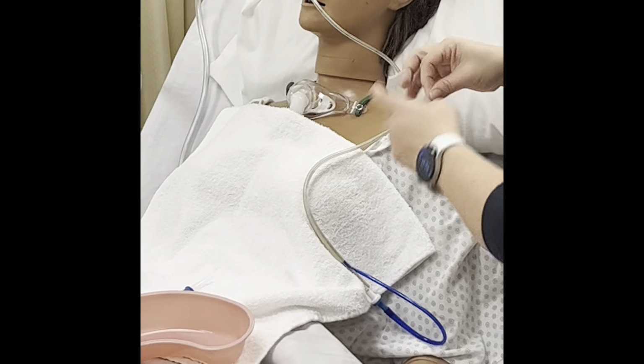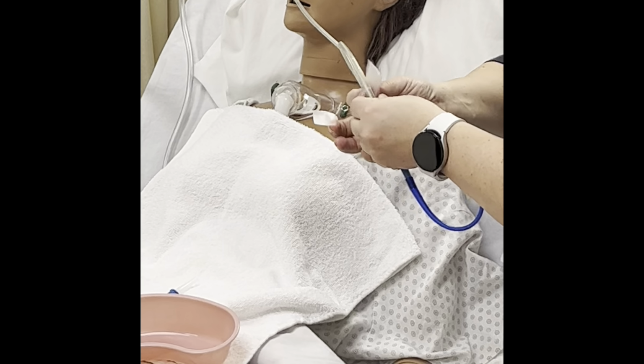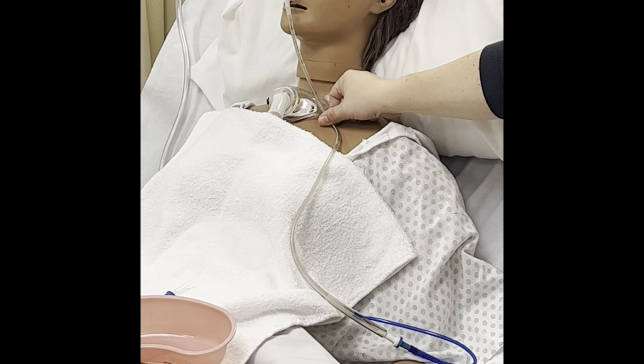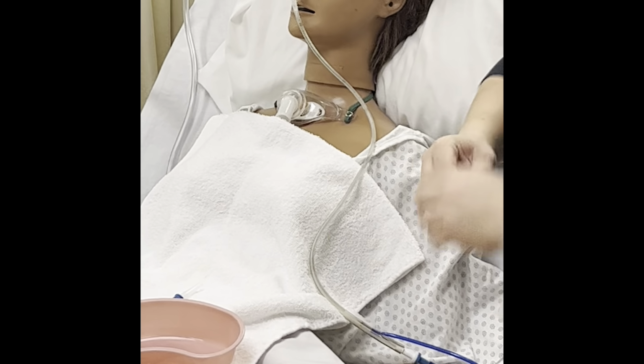You could just take this piece of tape and we want to put it towards the bottom. The reason why we want to put it towards the bottom is because we don't want this tube so tight that the person can't move their head and they feel like they're pulling it out. So we're going to put it at the bottom.